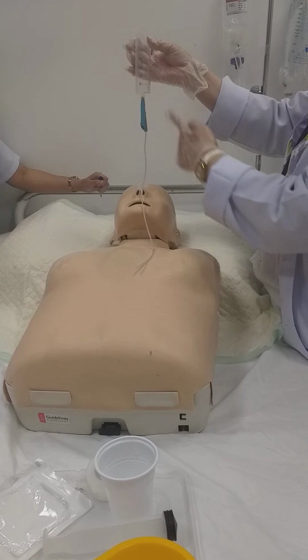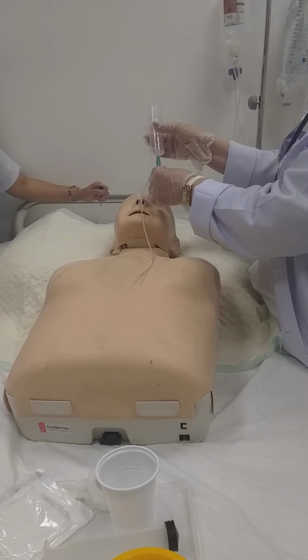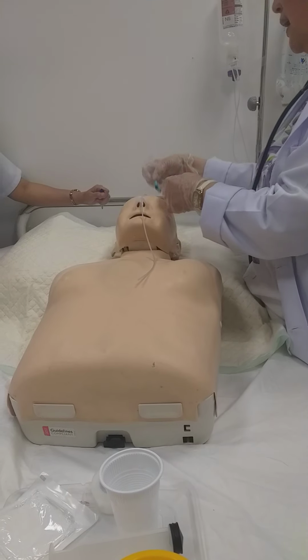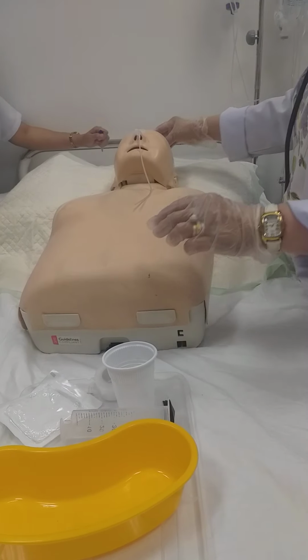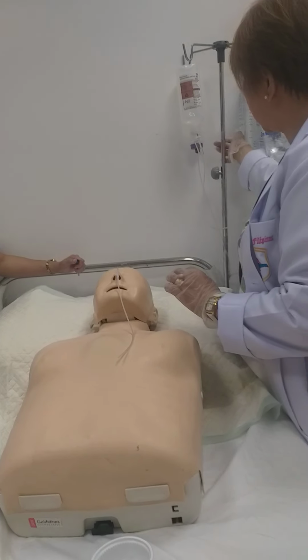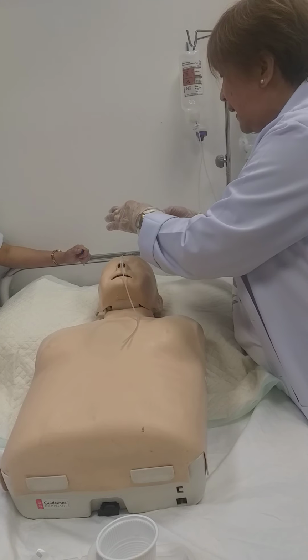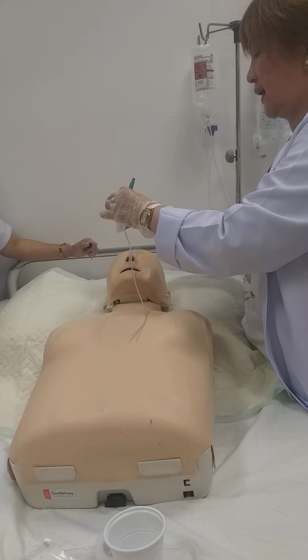Keep it higher like that so it will flow with the gravity. Pinch, close, disconnect, close. Okay? Disconnect, keep it aside. Now, get the last plaster and make a butterfly here.